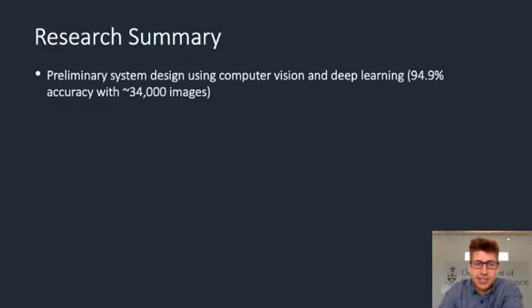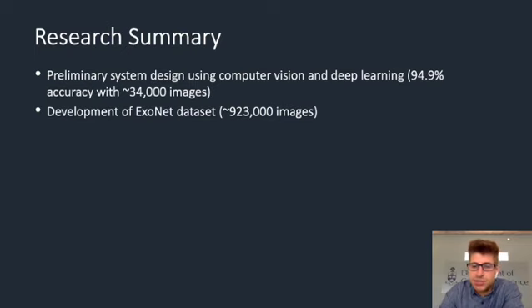So just to summarize, we designed a preliminary environment recognition system which established the feasibility of using deep learning for this new computer vision application. We also developed ExoNet, which still remains one of the largest computer vision datasets for robotic prosthetic legs and exoskeletons.